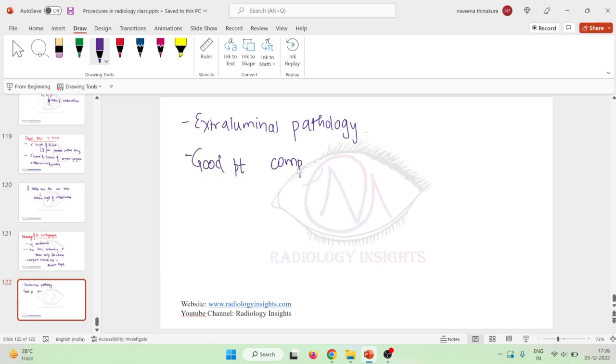The patient will like this procedure because it is more comfortable than micturating cysto-urethrography. And we can assess the urinary tract completely, from kidney to urethra. The whole assessment of the urinary tract is very easy with CT urethrography. So thank you.